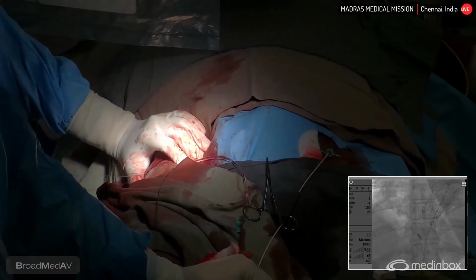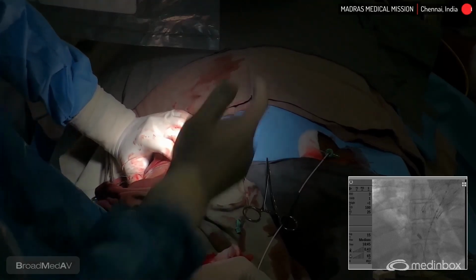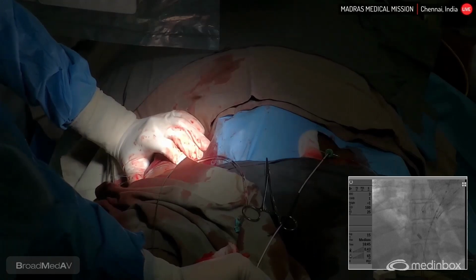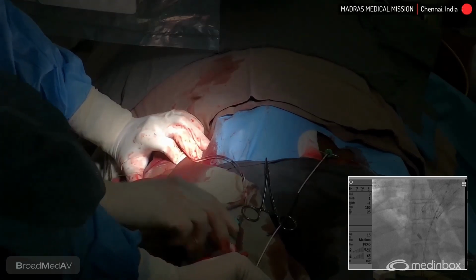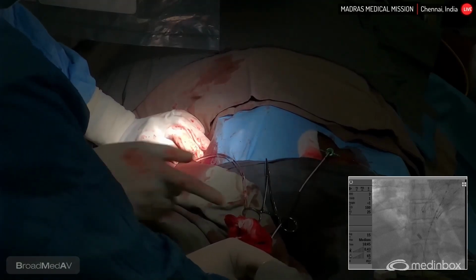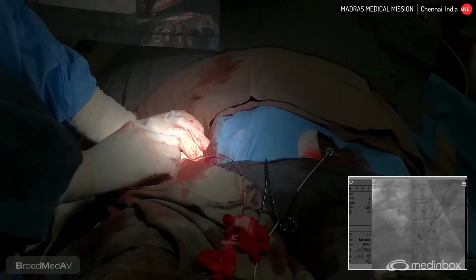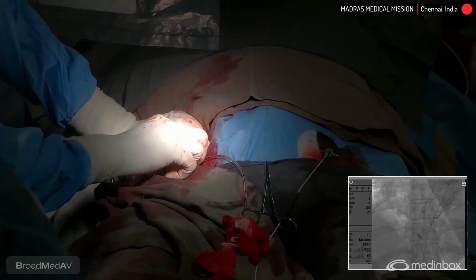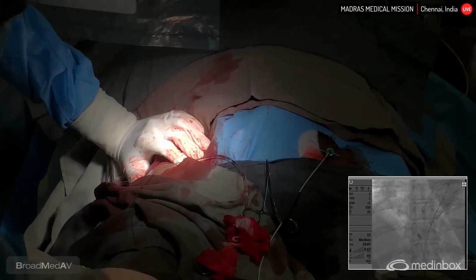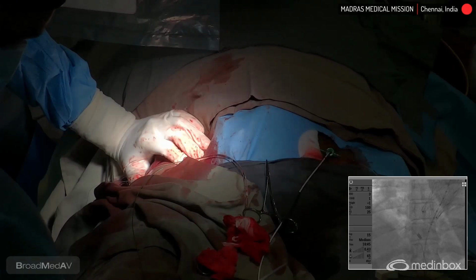So you have given protamine, right? 5 ml. No, first give me one 8 French angioseal. Okay, leave that. You just connect the pressure, sir. Okay, right. Just to put the 8 French angioseal over this. Ashish, you make this ready. Balloon.